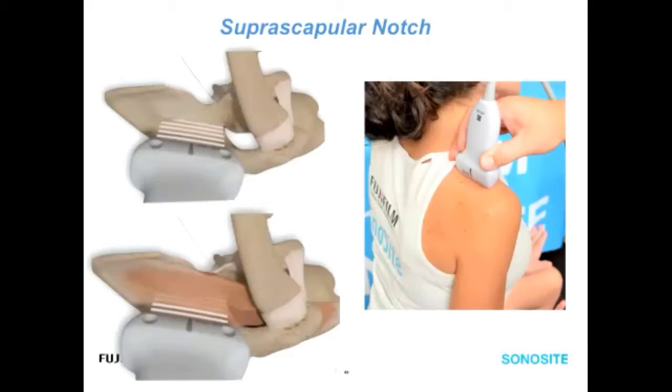midline and aim the beam anteriorly and just see what you can see, and look at the supraspinatus muscle, which we discussed in the lateral shoulder webinar and the posterior shoulder webinar, for atrophy. But if you have not explored the anatomy of the supraspinatus fossa down at the bony surface, this is a great time to learn that landmark.